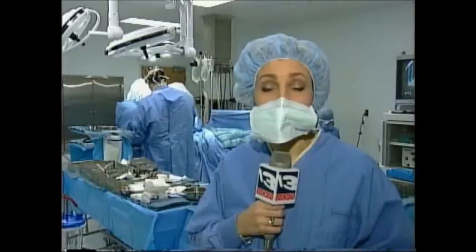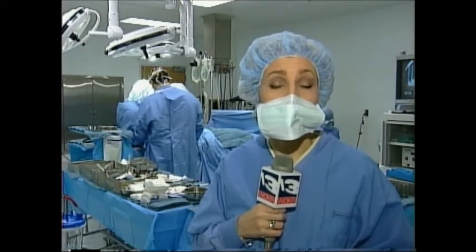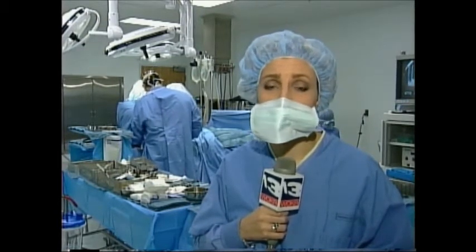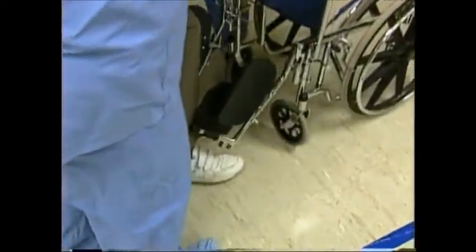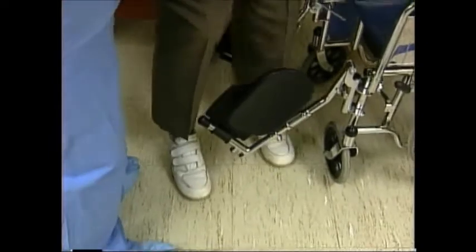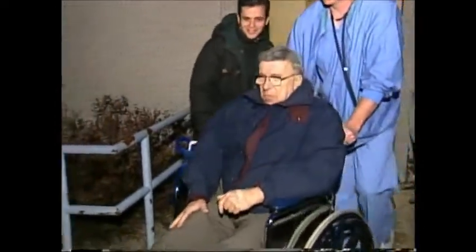The whole procedure can be completed in less than a couple of hours, allowing the patient to walk out of the hospital the very same day. With a little help, by late afternoon, Levy can put full weight on his knee. He leaves the hospital one step closer to a future that is pain-free.